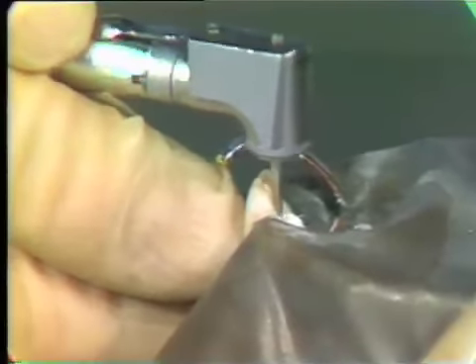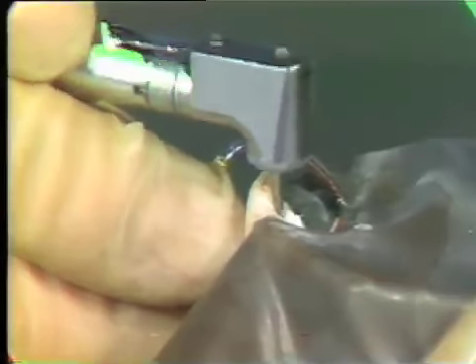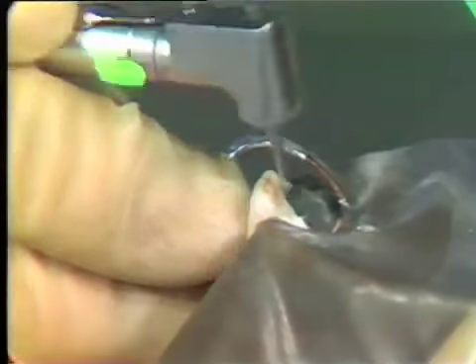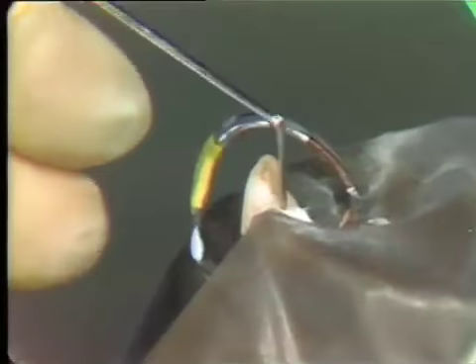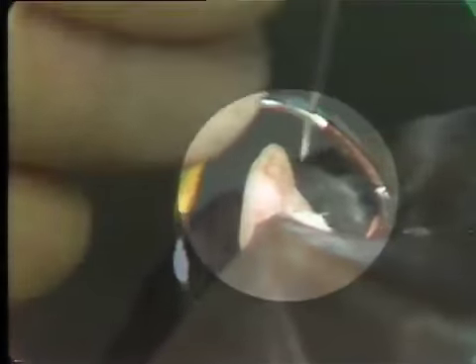Making sure to keep away from the walls and run the burr only against the roof. I check again. It feels fairly good to me, so I put my slow-speed handpiece aside. With my Endodontic Explorer, I'll go down and check. Yes, I can get access into the pulp chamber.